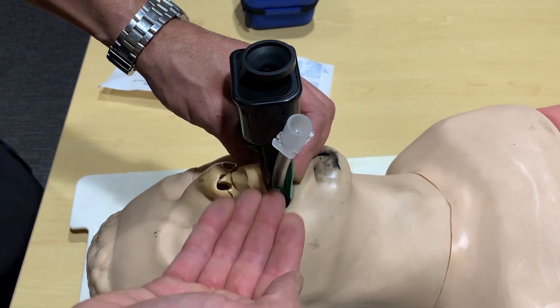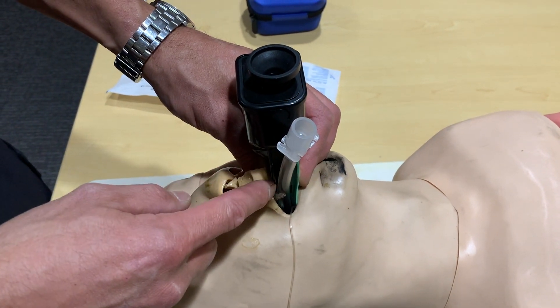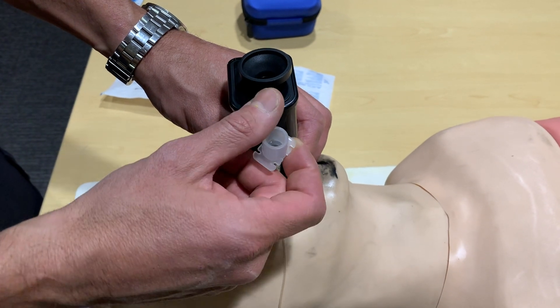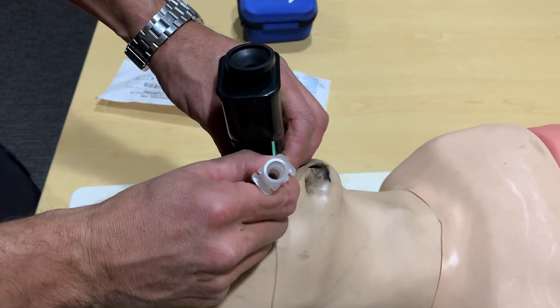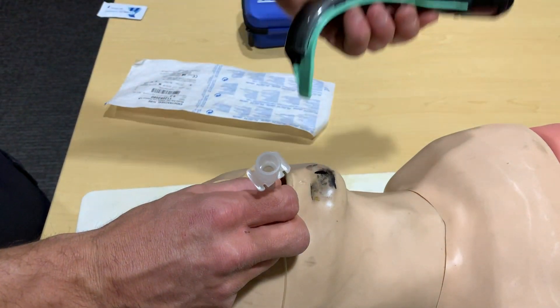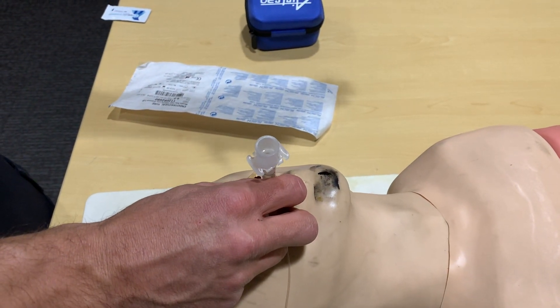To displace the tube from the channel of the blade, one method is to take your thumb and run it along the tube, then separate it from the channel to remove the blade from the tube and keep the tube in place without it dislodging.